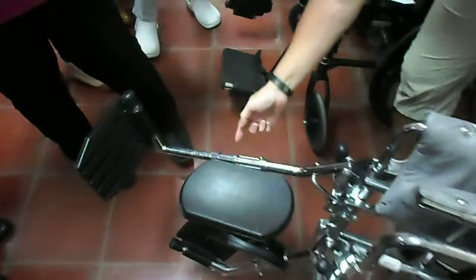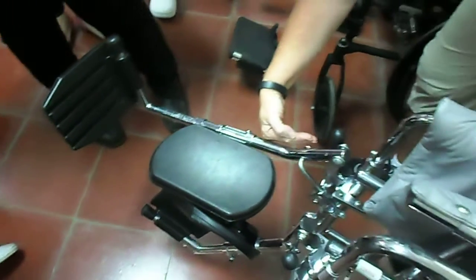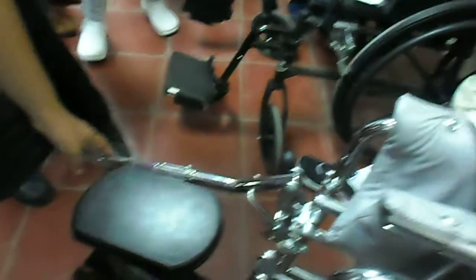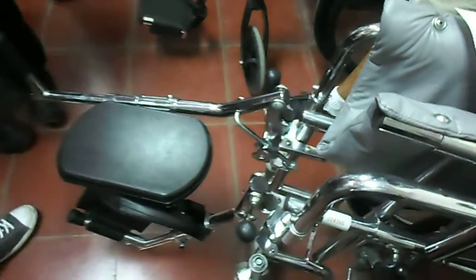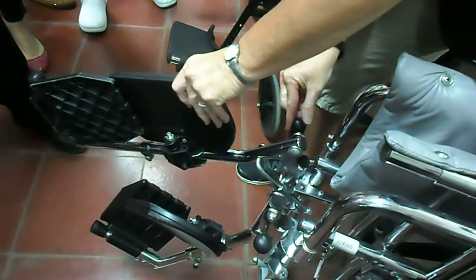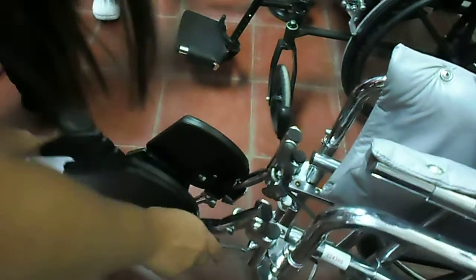We can change the length of this footrest by loosening this bolt and this piece here will telescope up to make it shorter or longer. Dependiendo de que tan larga sea la pierna o que tan corta, esto se puede modular y entonces esto se puede hacer más para arriba o más para abajo. That works by this little mechanism here — you just pull up, but to release it you have to push it to take it back down.